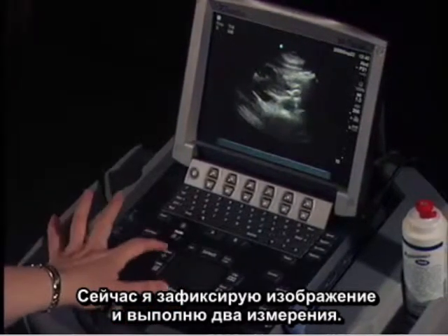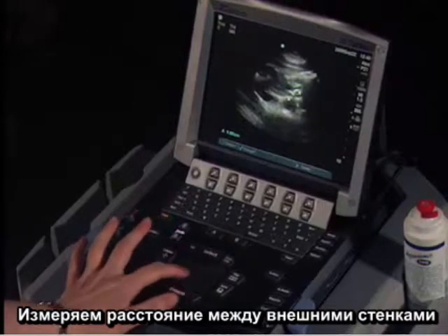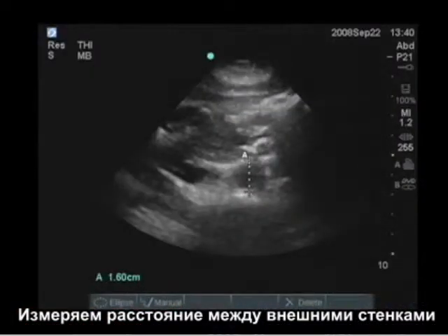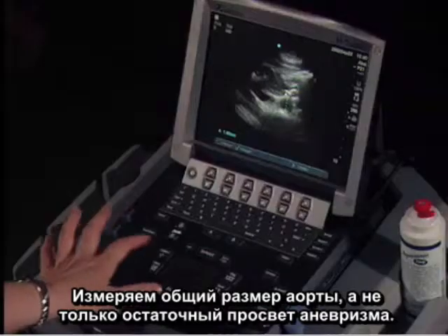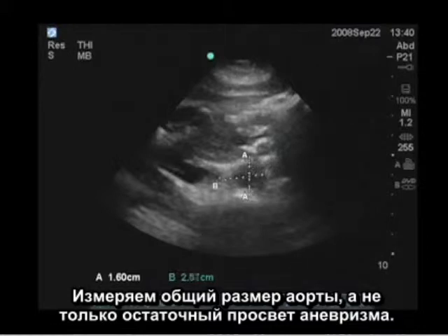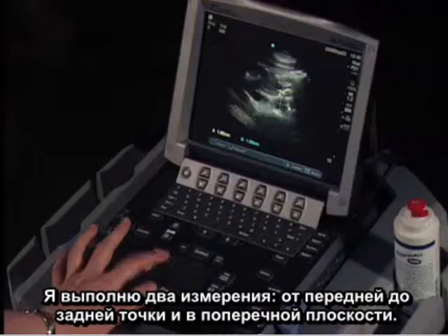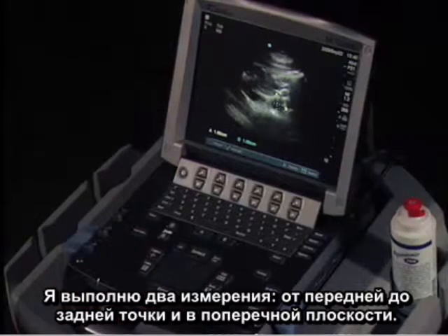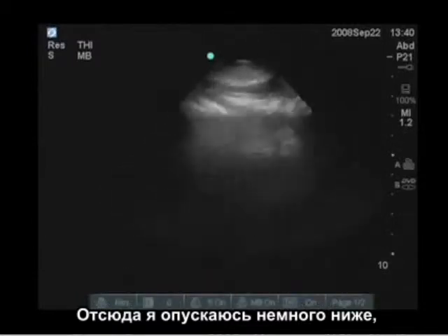and perform 2 measurements. Measuring from the outside wall to outside wall, so I measure the entire size of the aorta and not just the residual lumen of an aneurysm. I will perform 2 measurements, anterior to posterior, and a transverse measurement. From there, I'm going to move down a little bit more inferior.